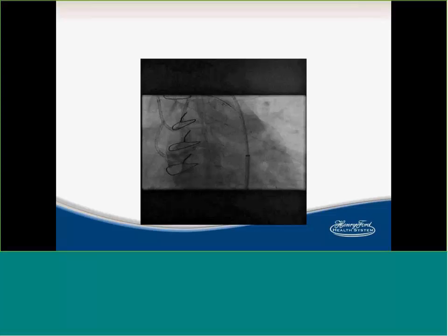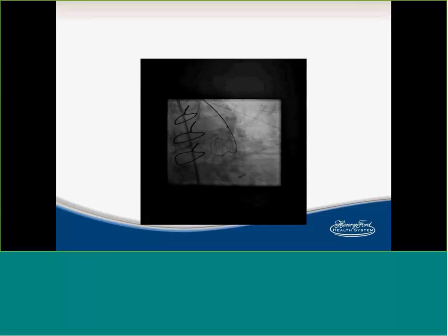Okay. Actually, that's a very great idea. You described this in one of your case reports, like external anchoring and also external crush. You can dissect around it. So what I did, I said, let me... I haven't performed a CART in a long time. So this is basically, I think, a Confianza Pro 12 wire.